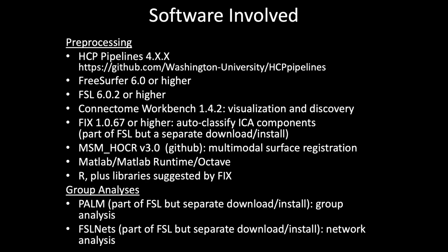So there's a lot of software that's involved with HCP. I mean, first and foremost are the pipeline scripts themselves. But then there are all the tools that it depends on. And these include things like FreeSurfer, FSL, the Connectome Workbench, which is useful for visualization and discovery. So that was what I used for some of the imaging displays. And it works really well with looking at data across multiple modalities.